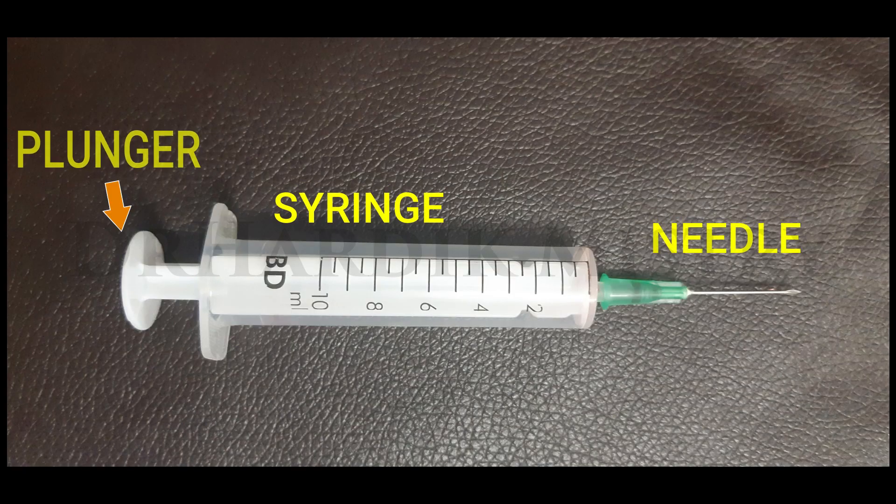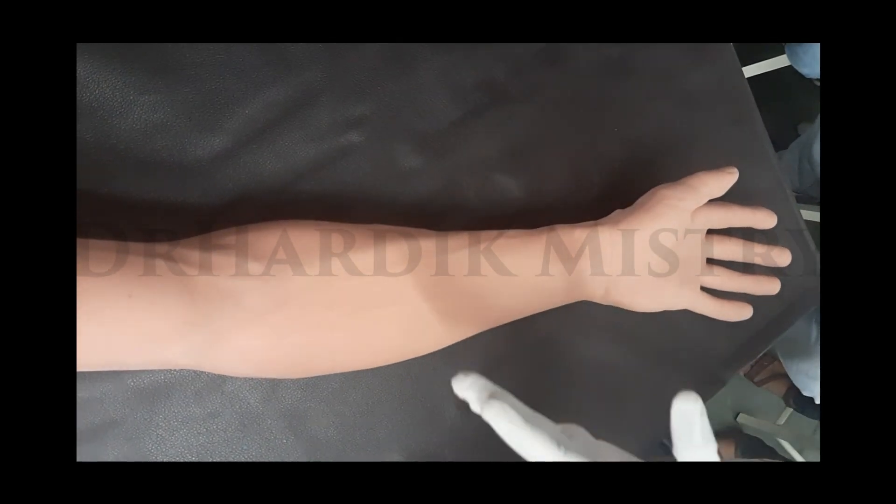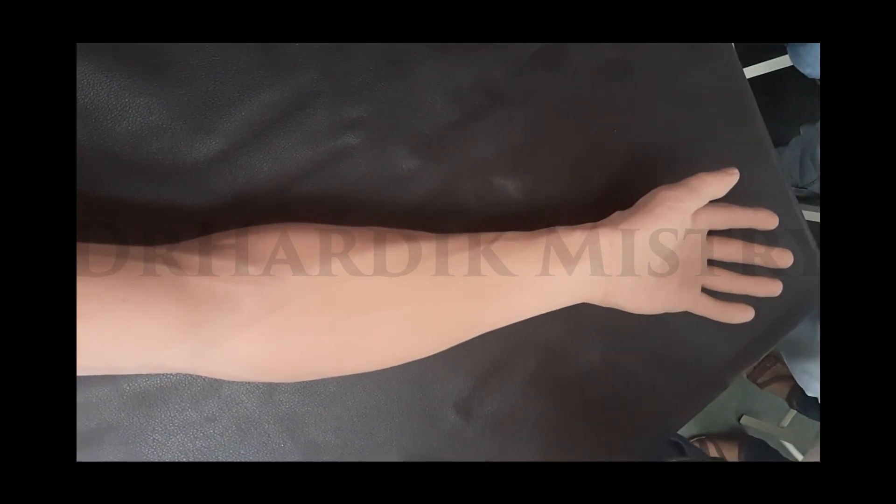This is the syringe, and this portion is known as the needle. The needle has a pointed end. When we look closely at the pointed end, there is a cross cut — this part is known as the bevel. Whenever we try to insert this part inside the anticubital vein, this part must be facing up.